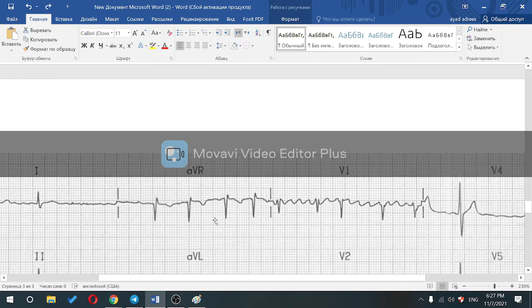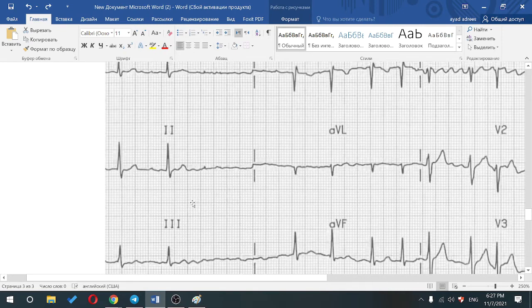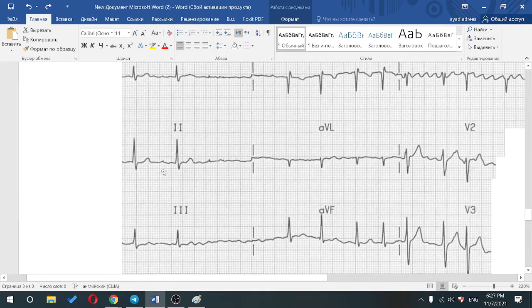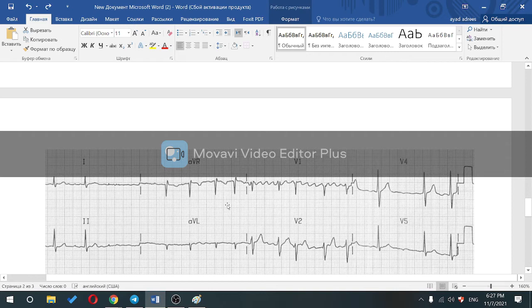Because I remember this case. So here's the thing. For some, I did not even know about this personally. A patient can have a flutter and fibrillation at the same time, if he has an ectopic focus activated in the left atrium and an ectopic focus activated in the right atrium. So as you can see in this lead, the patient has no P wave. So this is suspected of AFib. At the same time, if you look at V1, you can see this saw wave appearance. So this saw wave appearance, it's an A flutter, exactly. So the patient has both an AFib and an A flutter.